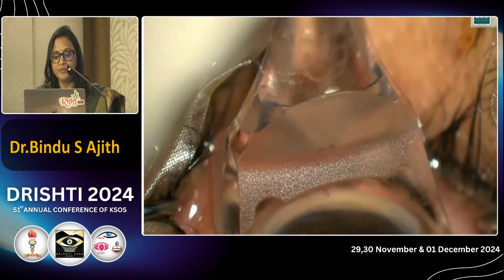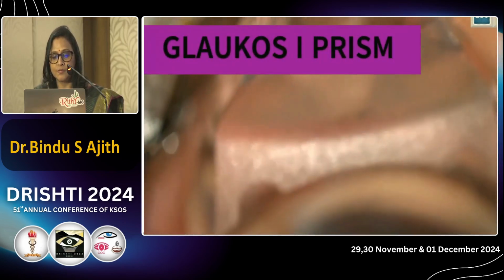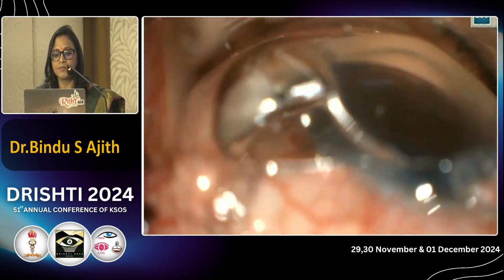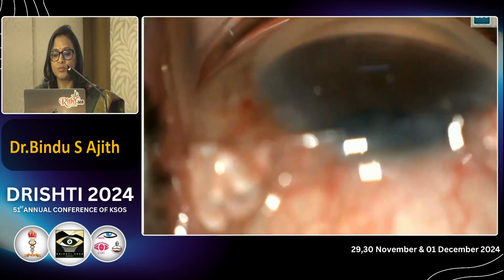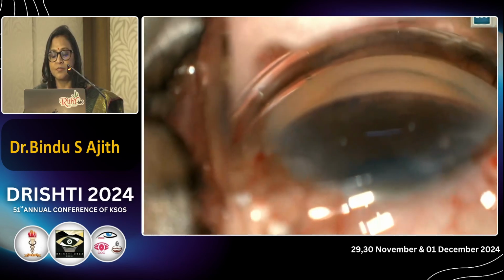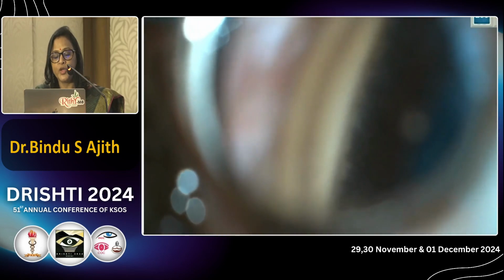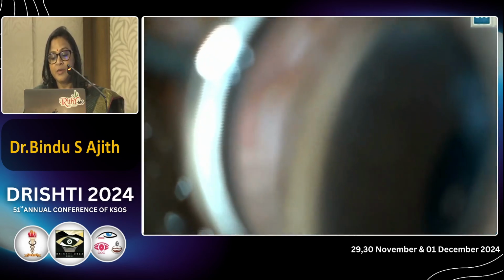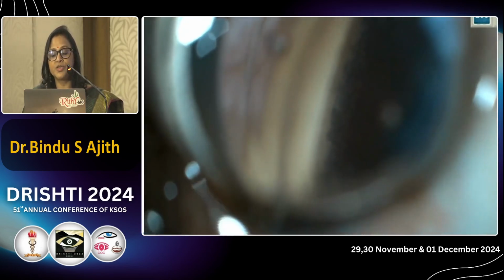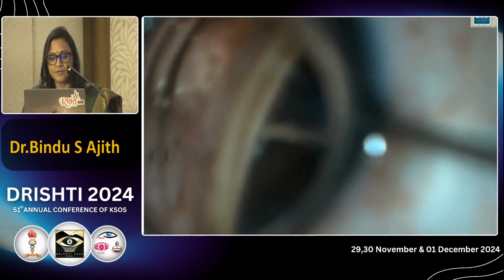This is the eye prism with a wider view. What we don't want is a steep angle view, where you keep your lens more anterior, and it becomes difficult, not only in visualization, but also when you're doing a procedure and introducing the instrument.